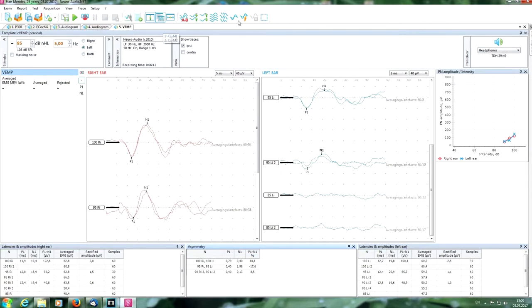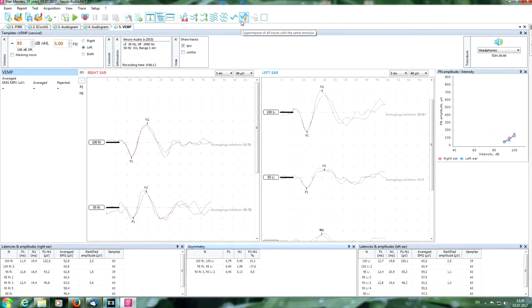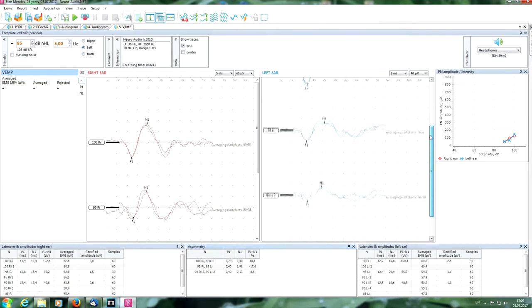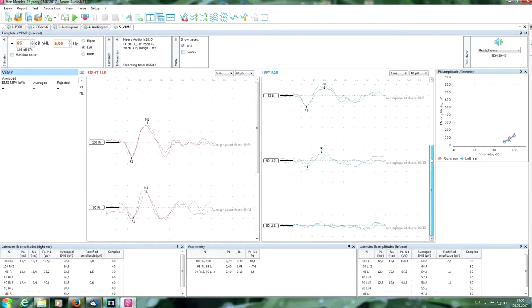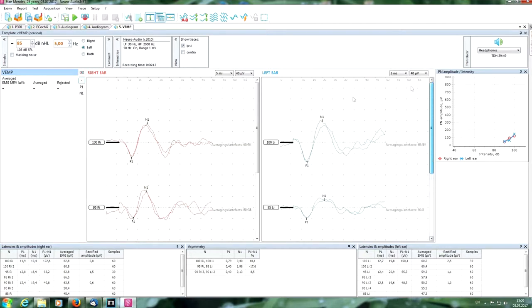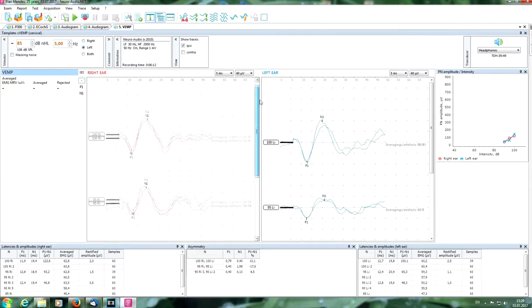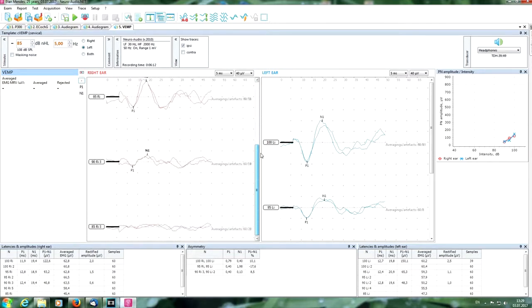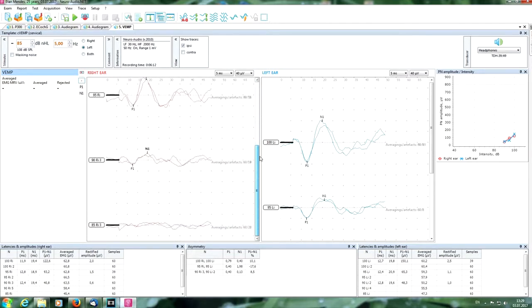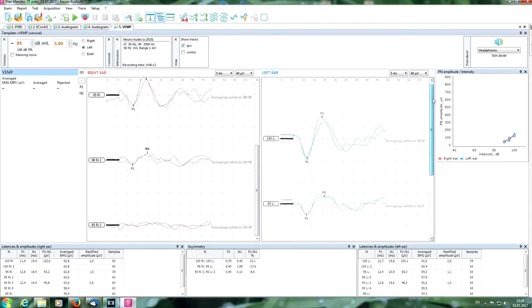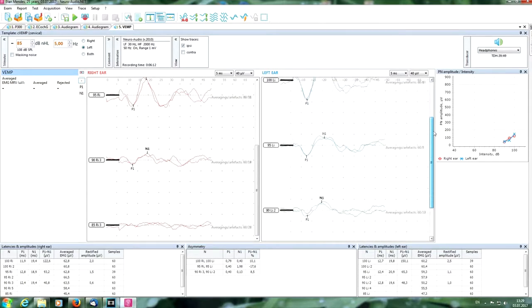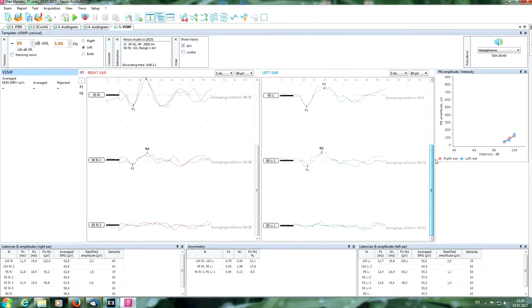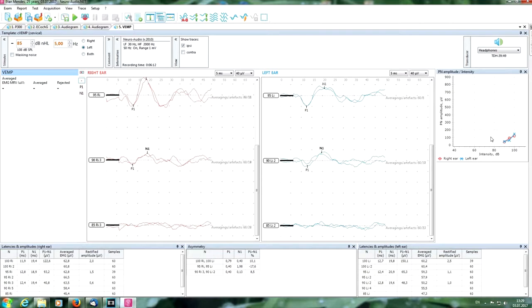Overlay and matched. Here on the left side, here on the right side, visually you can see that our threshold is 90 decibels on both sides. You can see here that we have good asymmetry percentage, it's normal. Here in this table we can see the graphics of amplitude decreasing, and the threshold is 90.